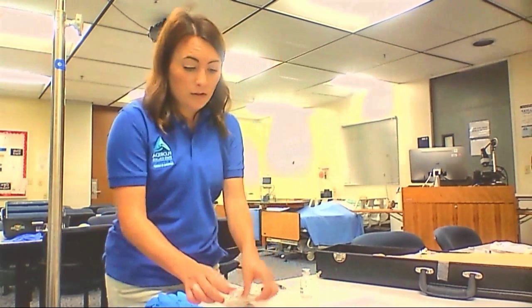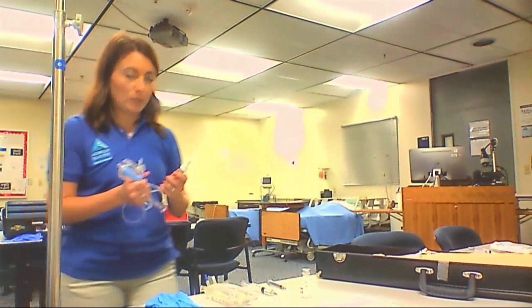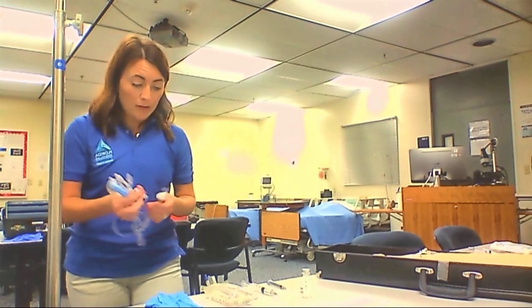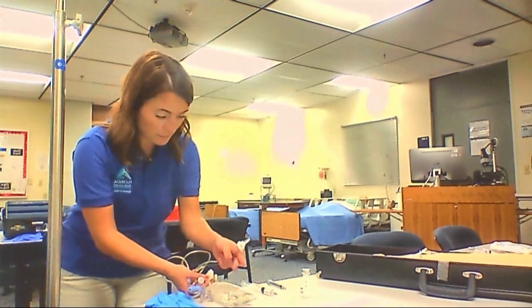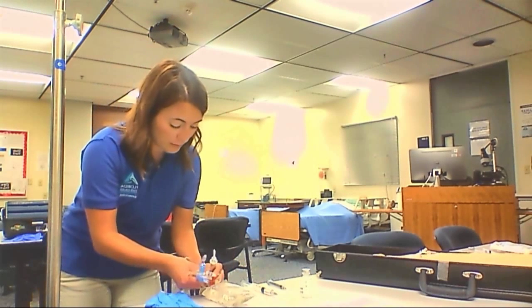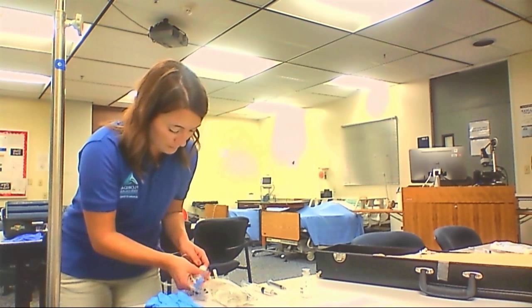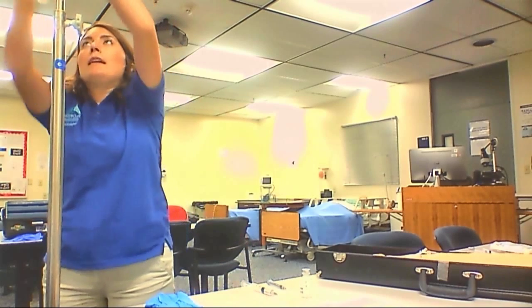After that, I want to get my IV tubing prepared, which is right here. I want to label the tubing with the date, time, and my initials, that way people coming behind me know that I was the one who started the IV. I'm also going to connect the two. Again, cleaning, making sure that we have everything clean. Then I can go ahead and hang my bag.